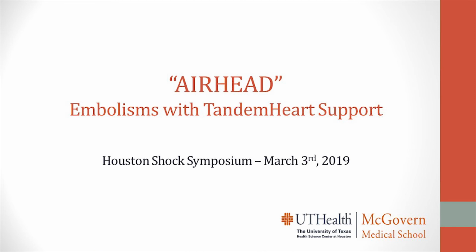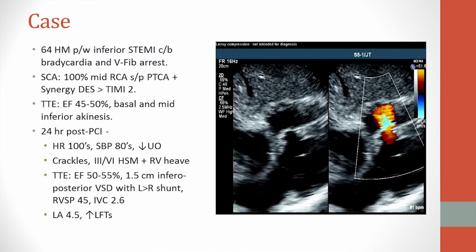The case I'm presenting today is titled Embolisms with TandemHeart Support. This is a 64-year-old Hispanic male originally from El Salvador. Medical history included AFib, had an ablation in 2010, and also has hypertension. He is the breadwinner of his family, had 3 kids, was fully functional, and played soccer on weekends.